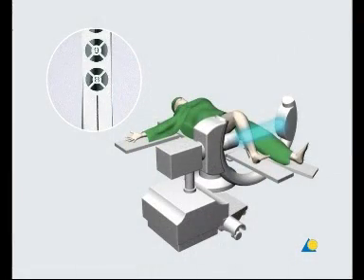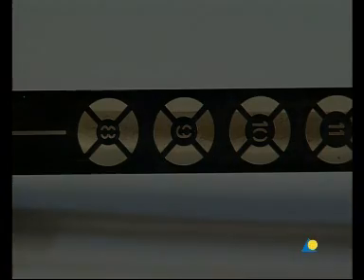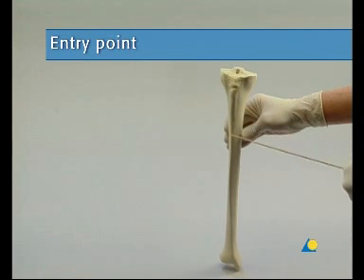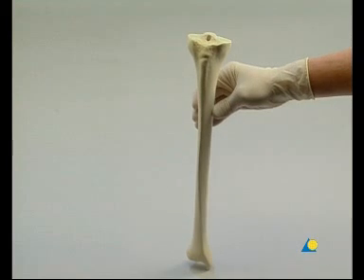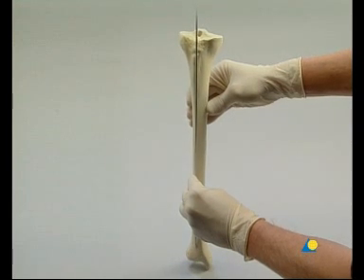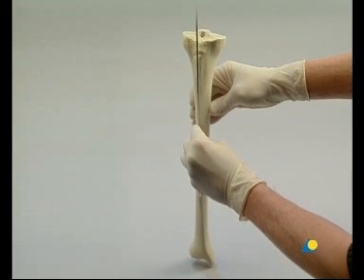The image intensifier and radiographic ruler are also used to establish the appropriate diameter of the nail. The entry point is decisive for the position of the expert tibial nail in the medullary canal. This position is most important for correct fragment alignment of proximal and distal metaphysial fractures. In the AP view, the entry point is in line with the axis.